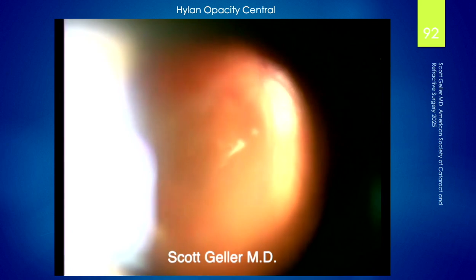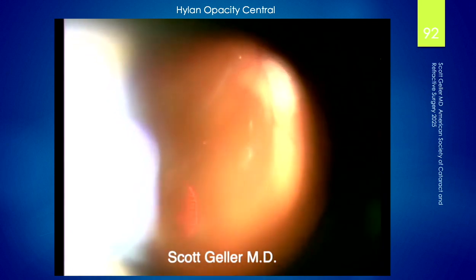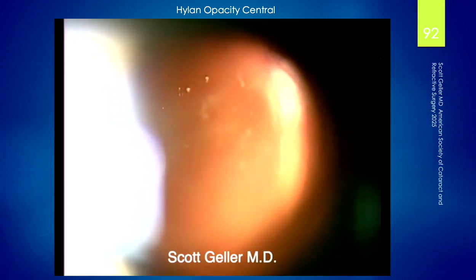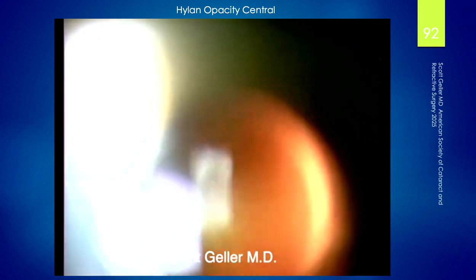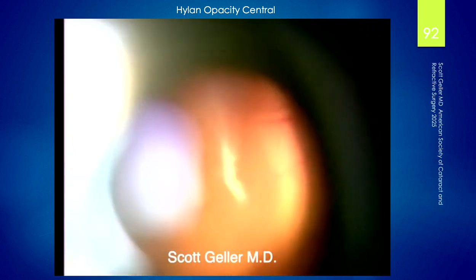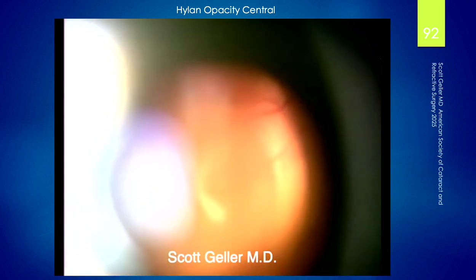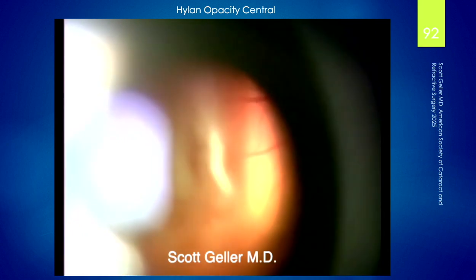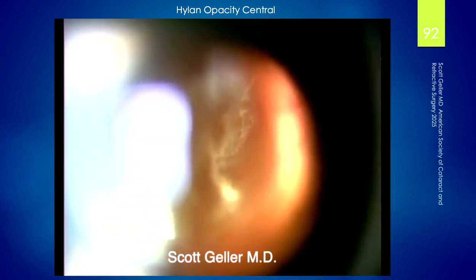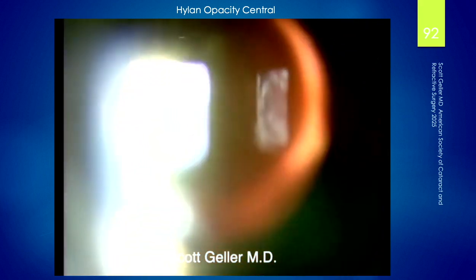But the patient's description wasn't exactly, I do remember that. It wasn't exactly like, well, there's this very distinct C-shaped looking thing slightly in the periphery. So at the laser, the view is a little different. All of a sudden, I saw this thing, this big fibrillar mass in the visual axis. And it's like, do you see something that looks like a vertical bar, vertical fuzzball?